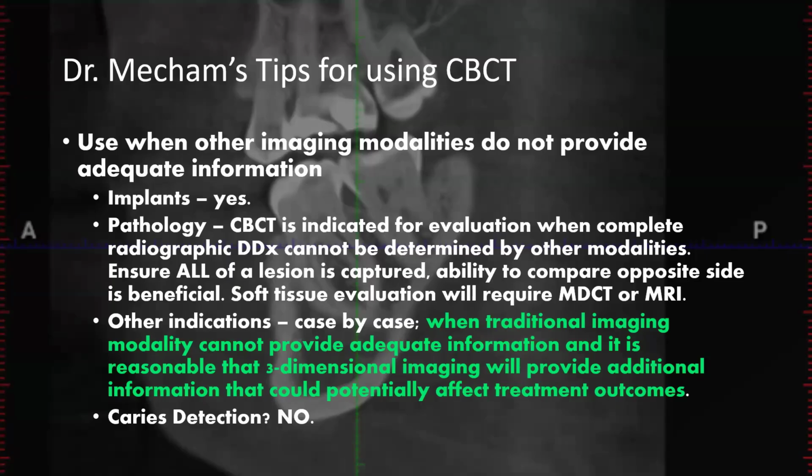That's more of a panoramic 2D diagnosis. You'll see those, be able to recognize those. Hopefully your faculty can recognize those. If not, I can take a look at it and confirm, yeah, it looks like that. That doesn't mean it's a definite diagnosis. It's not going to be 100%, but when you're 99.9% certain, and it's not going to require treatment, probably not going to require a CBCT analysis.